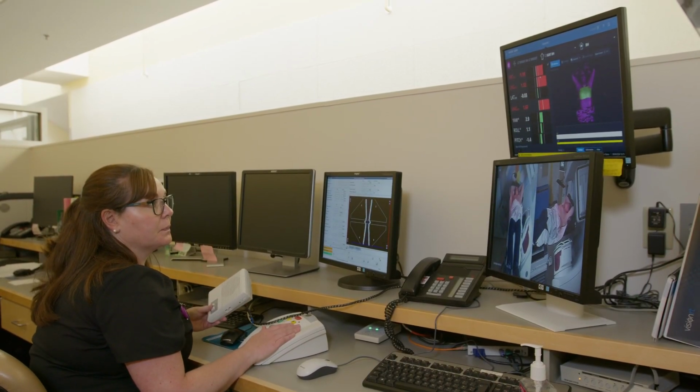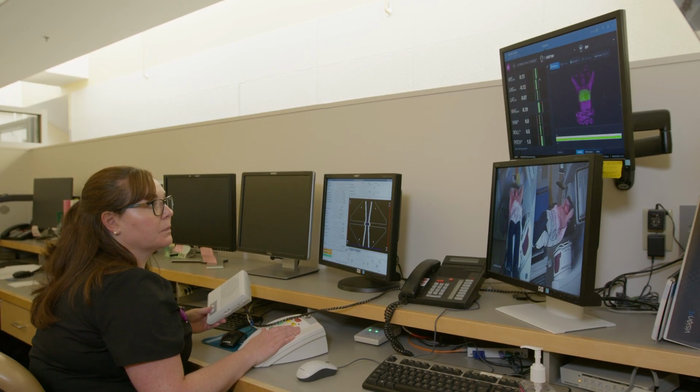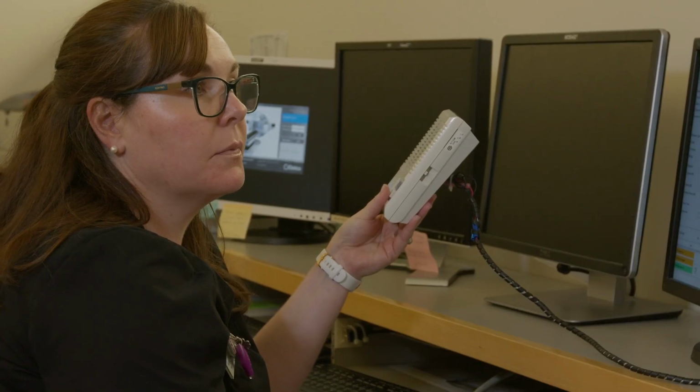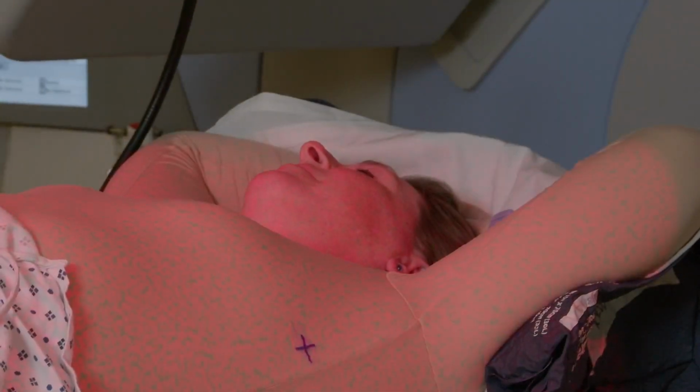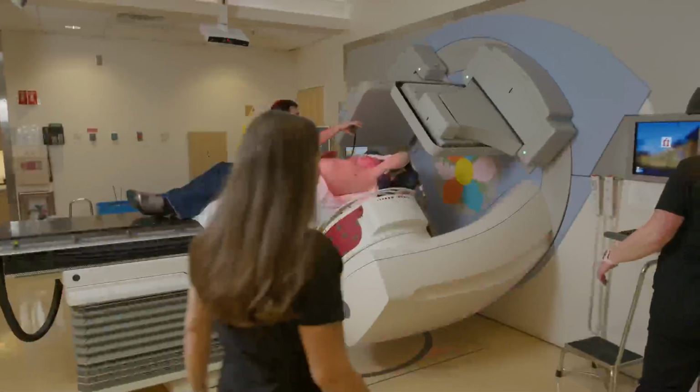Remember that the therapist will talk to you throughout the treatment, so please speak up if you need anything. Once the treatment is complete, the therapist will instruct you to breathe and bring your arms down. The red lights will turn off.